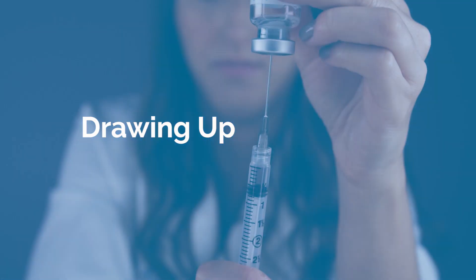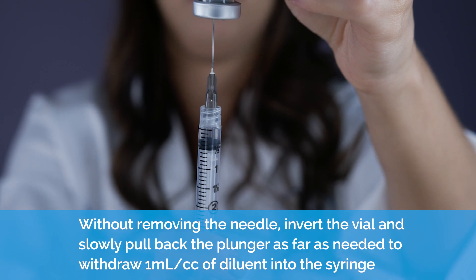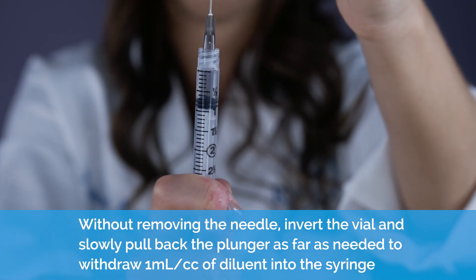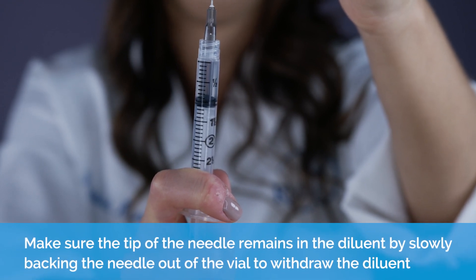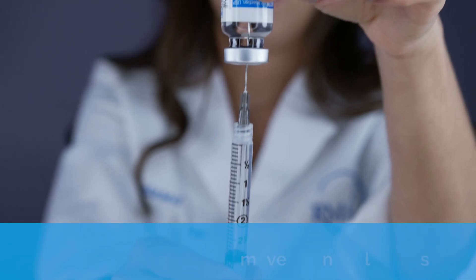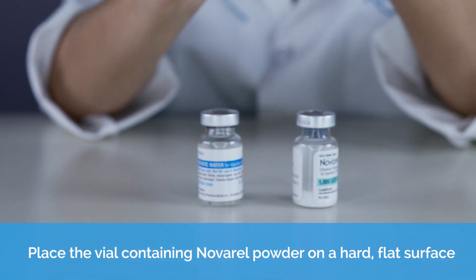Drawing up. Without removing the needle, invert the vial and slowly pull back the plunger as far as needed to withdraw one cc or milliliter of liquid into the syringe. Make sure the tip of the needle remains in the liquid by slowly backing the needle out of the vial to withdraw the liquid. Remove the needle and syringe from the vial.